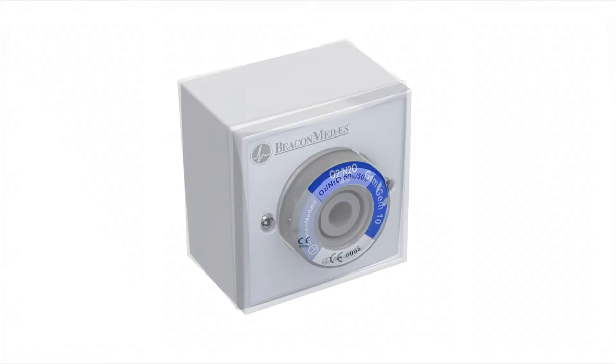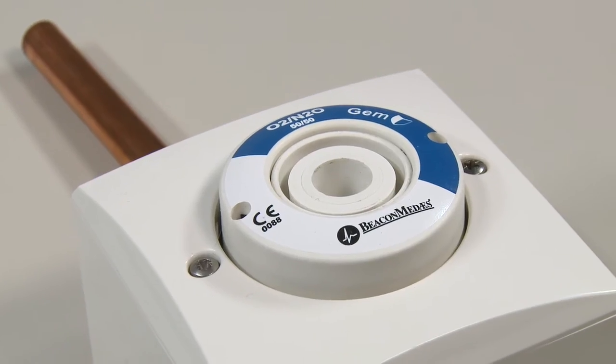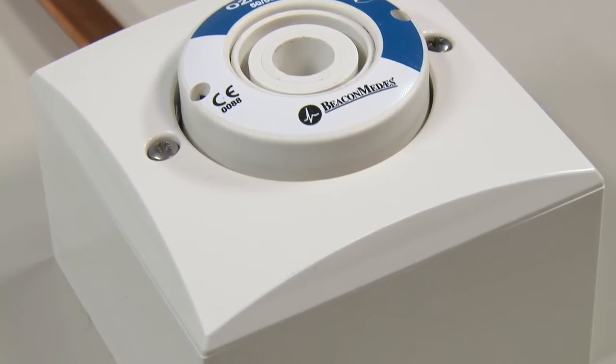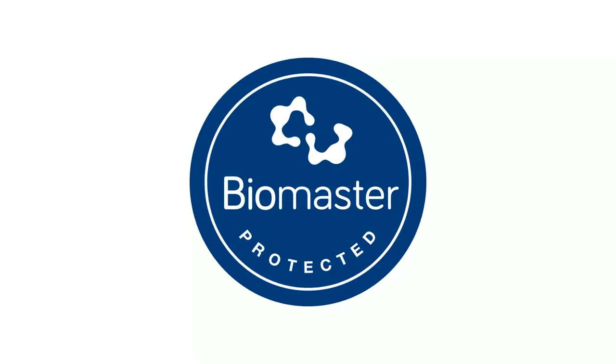The curved trim plate replaces the existing fascia plate to match the modern aesthetic of the GEM Shield outlet. This has a simple curved profile to eliminate dust traps for improved infection control. The new trim plate also includes an antimicrobial additive for ultimate patient safety.